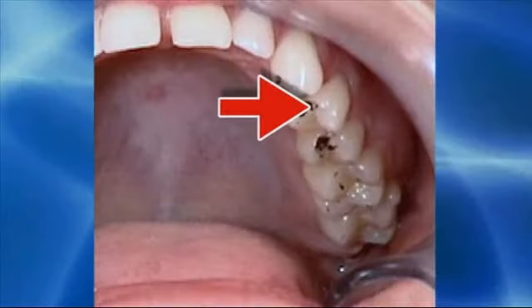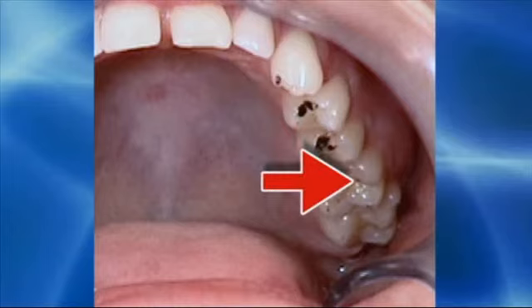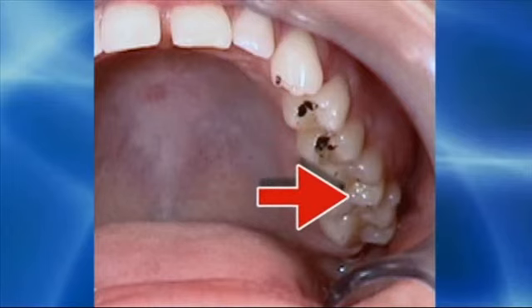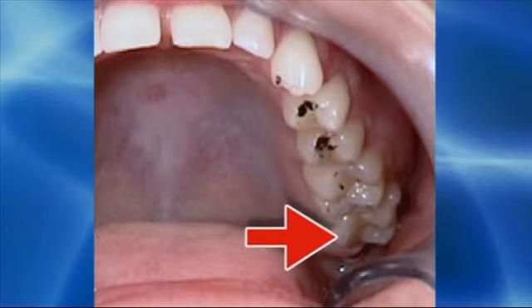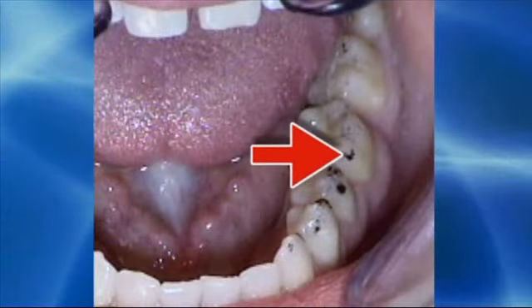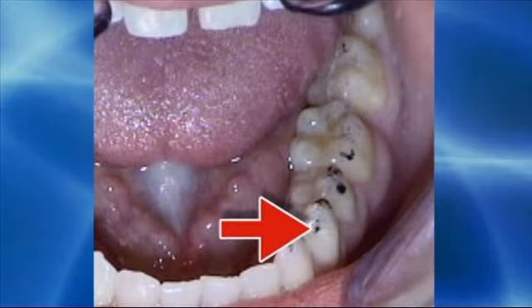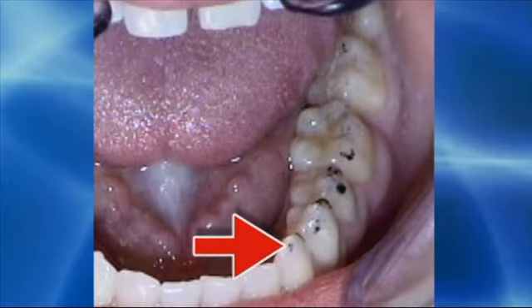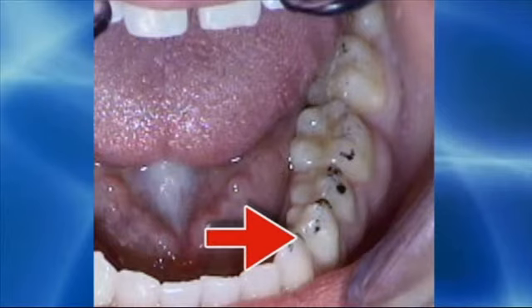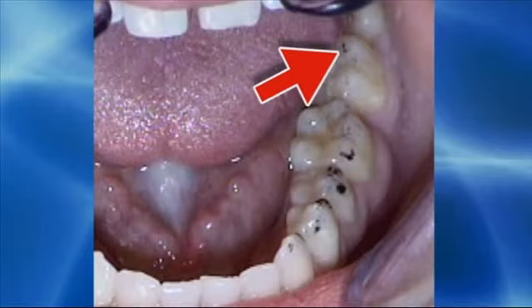On the left side, you have working side group function on the two bicuspids and on the first molar, and balancing incline on the second molar. On the lower teeth that contact those same upper teeth, you see cheek side group function on all the molars and the two bicuspids, and you see the guidance could be on the canine if there was less posterior tooth contact in the way, and there's also the balancing incline on the distal buccal aspect of the second molar.